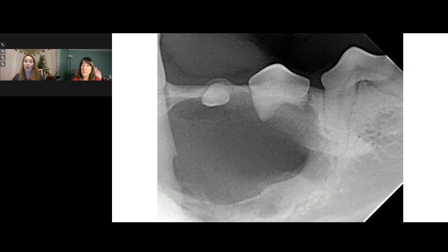the anatomy of the teeth and the angles behind what you're doing. And I don't mean by looking at 35 degrees and all of that. I don't do them that way. I understand the anatomy of the tooth. I understand where I need to come from in order to get that tooth to show up on my image and make adjustments accordingly.